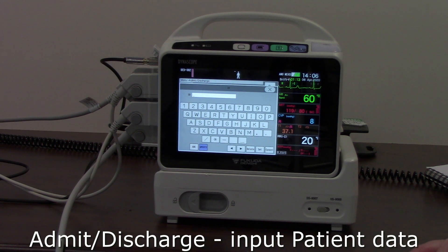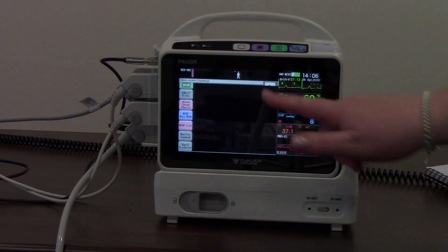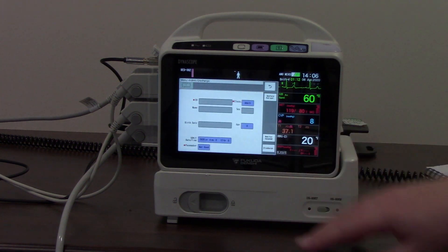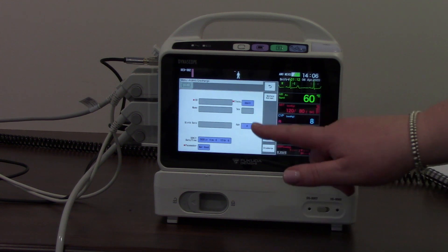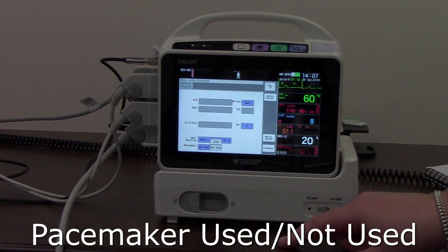We can input patient hospital number or ID, patient name, and date of birth. We can also indicate whether the patient has a pacemaker or not — used or not used.